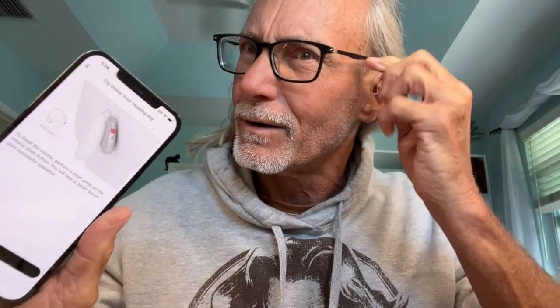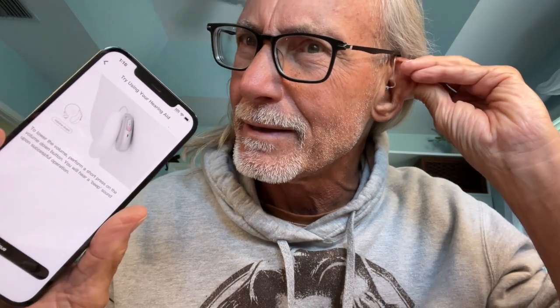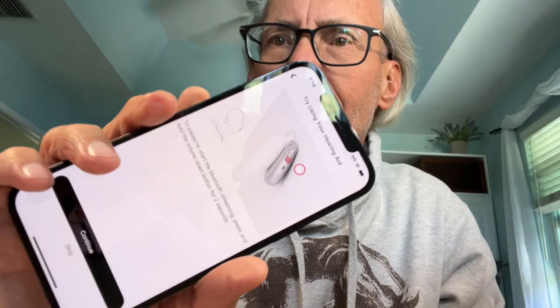All right, so I did that side. And I'm going to go on this side. I'm going to press the bottom part of the button, and it lowers the volume. All right, let's continue.